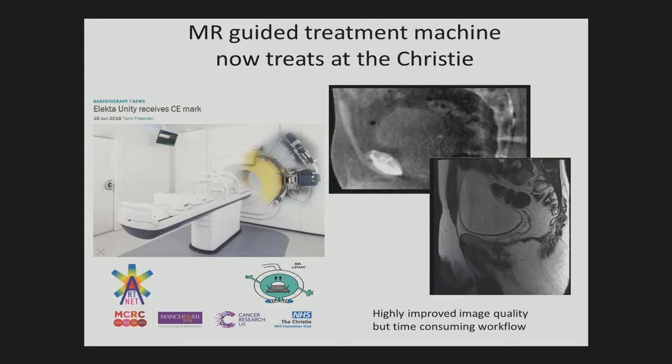The coil is cooled with liquid helium, very super cooled, so you have a superconductive magnet, and the magnet aligns the spins in the body, and you change that spin with radio waves, and you measure the resulting signal, and as a result you can get a signal which is related to the chemical characteristics of the body rather than the density. CT measures the attenuation to X-rays, so that measures the density of the tissue.